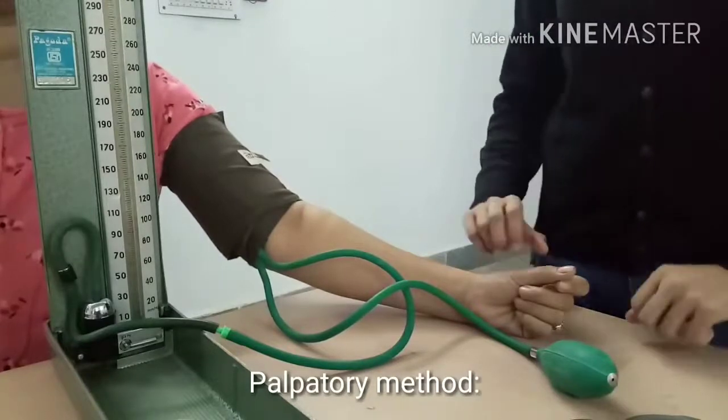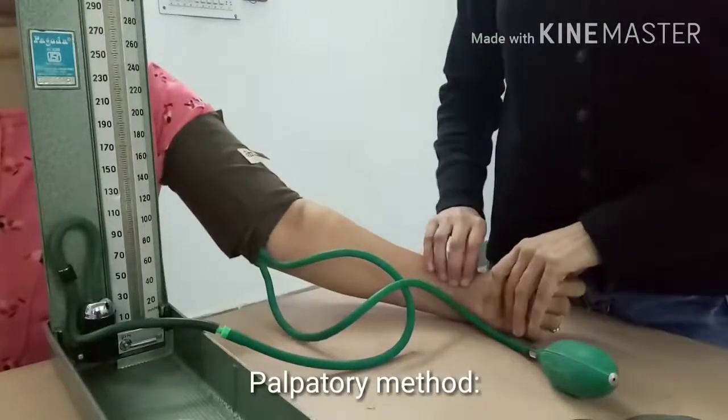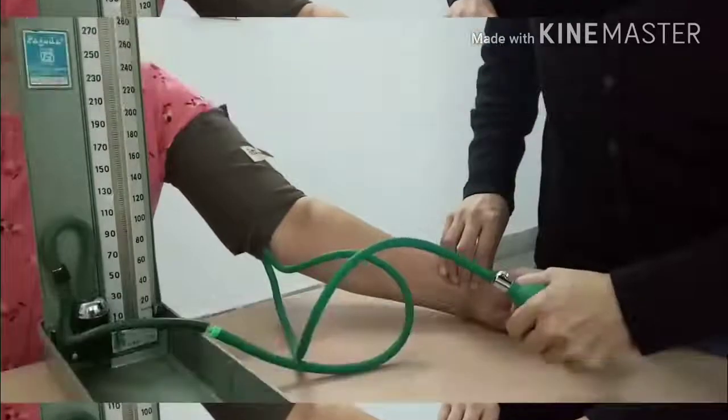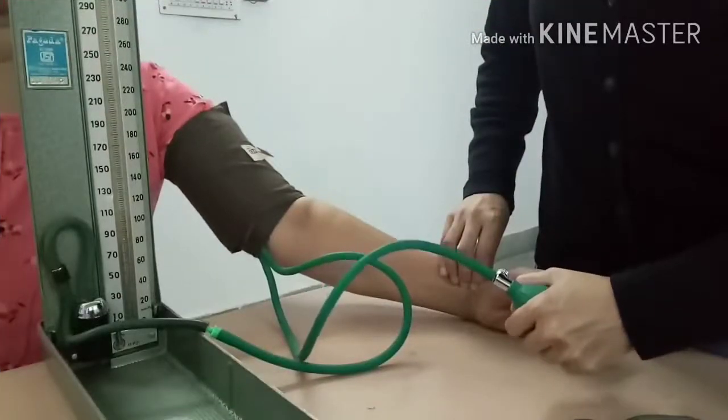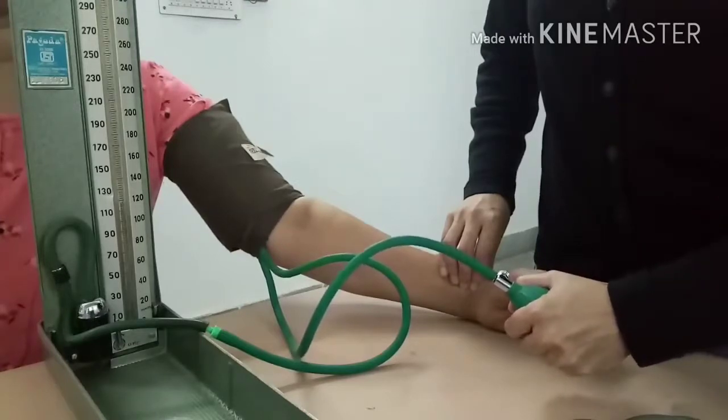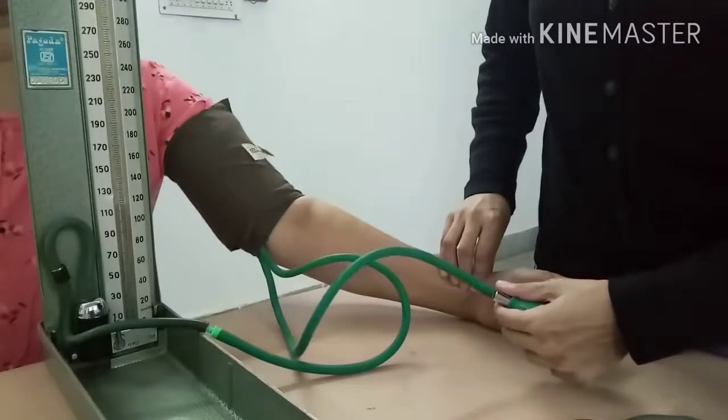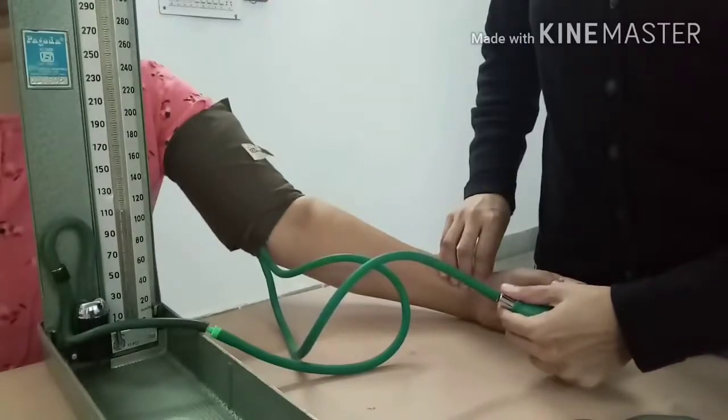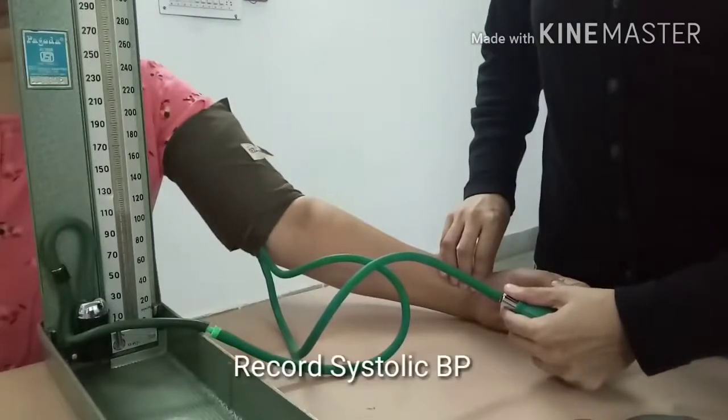Palpate the radial pulse. Inflate the bag gradually till the pulse at the wrist disappears, then deflate the cuff very slowly and note the pressure at which first pulsation appears over the radial artery.